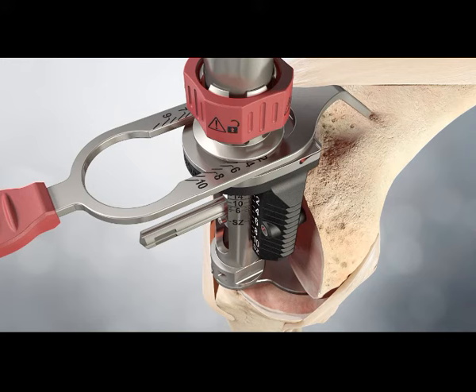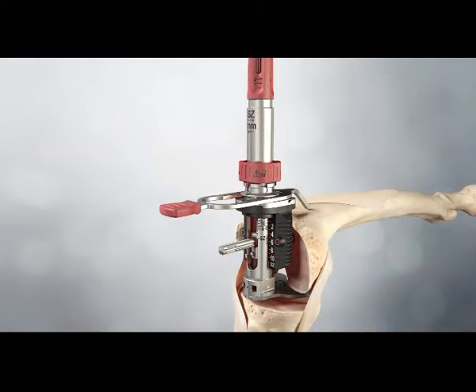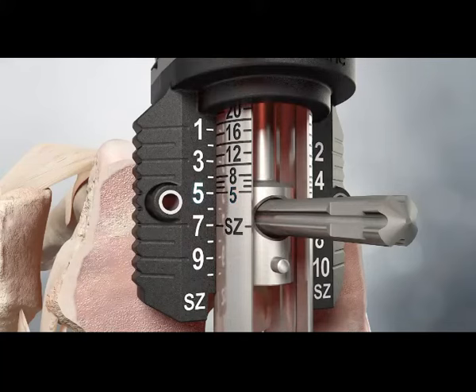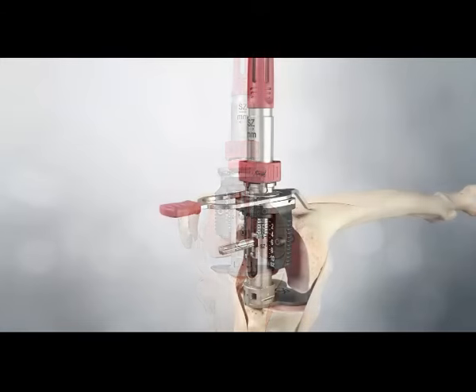The guide is firmly placed against the distal femoral cut. The position of the stylus indicates the exit point of the saw blade. The superior inferior position of the stylus is adjusted to match the approximate femoral size, then read the femoral size on the outer scale of the guide indicated by the size line on the main body of the sizer. With the femoral size and extension gap determined, the sizer may now be used to assess the flexion gap in comparison to the previously determined extension gap and to set femoral rotation. The tensioning knob is turned clockwise in the direction of the millimeter arrow until the previously determined size on the outer scale matches the millimeter thickness on the inner scale, which matches the previously determined extension gap. With the tibia held firmly, a varus valgus stress is applied and the liftoff observed between the sizer foot and the tibial cut. If further tension is required, the knob is turned clockwise until the next thickness of insert is reached and a further assessment of the ligaments made.